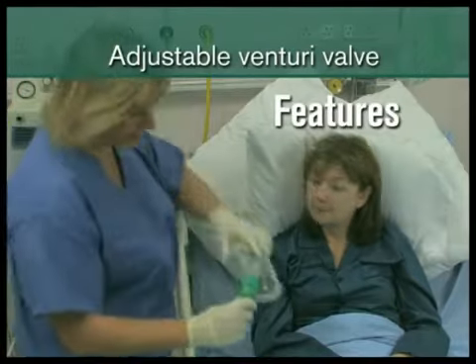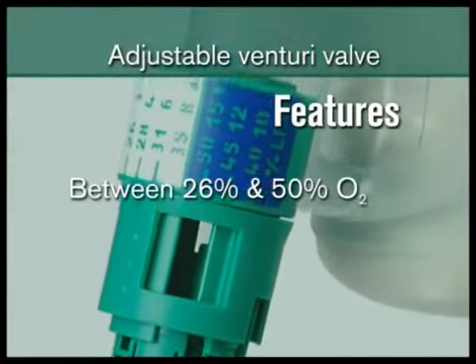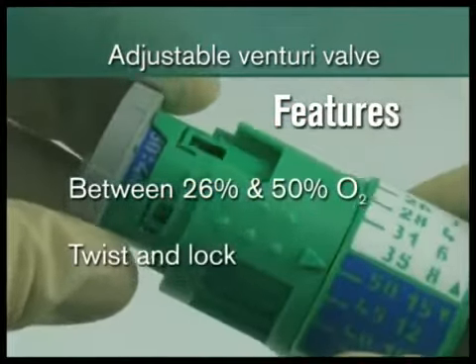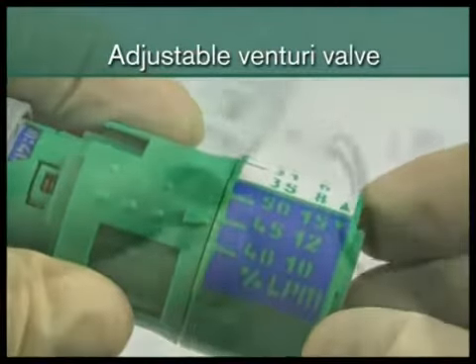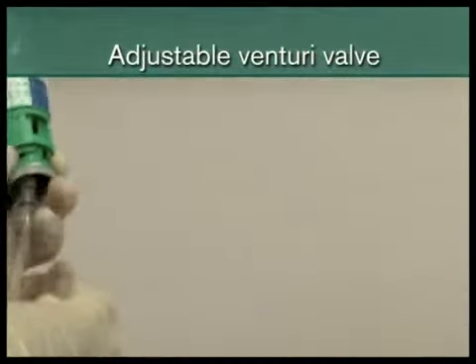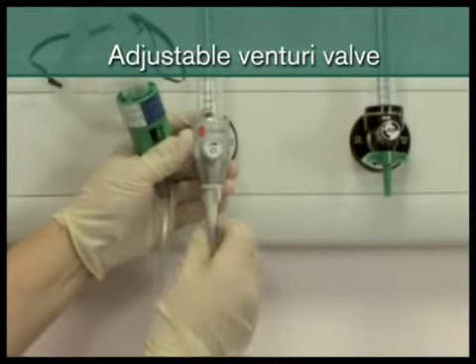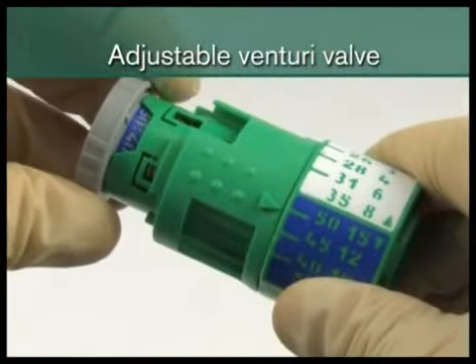The Silente adjustable Venturi can be set to concentrations between 26 and 50% and incorporates a twist lock mechanism to prevent inadvertent concentration changes. As with a fixed valve, attach one end of the oxygen tubing to the valve spigot and the other to the oxygen flow meter. To select the desired oxygen concentration, ensure the range selector sleeve is in the appropriate position.